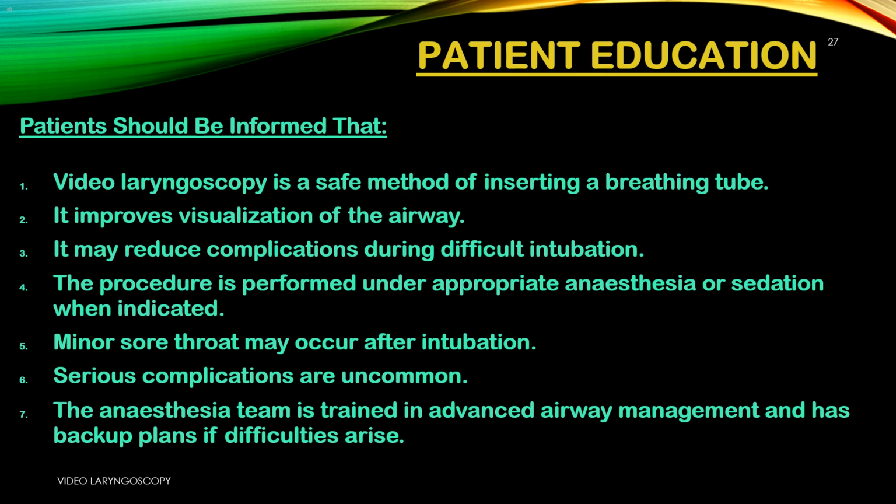2. It improves visualization of the airway. The doctor can see the vocal cords on a screen. This gives a clearer view than with direct laryngoscopy. 3. It may reduce complications during difficult intubation. Fewer attempts are usually needed. This lowers the risk of injury and low oxygen.